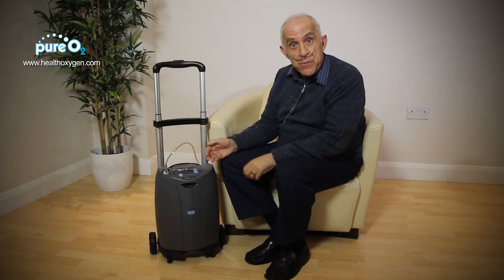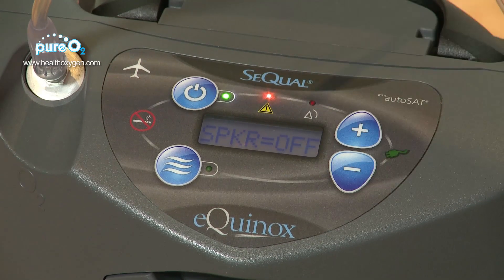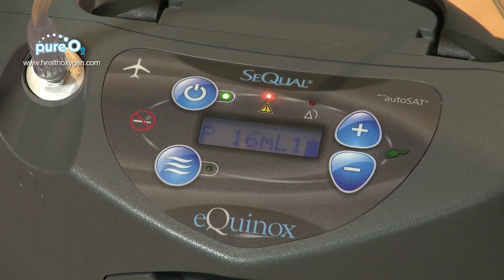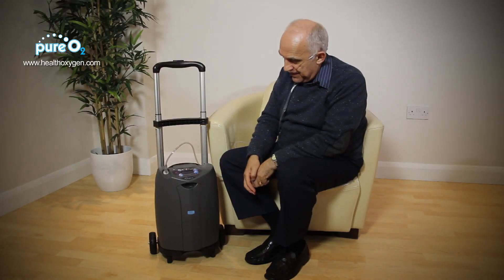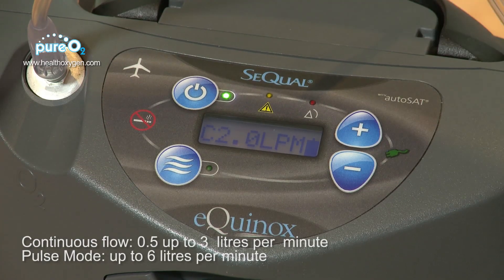You'll notice that there is a voice prompt, and you can turn this off by pressing this button and the minus button. It's currently in continuous flow, and if I press the button it's now in pulse mode. If I press it again it's back in continuous flow. You alter the flow rate with the plus and minus buttons to your required settings.